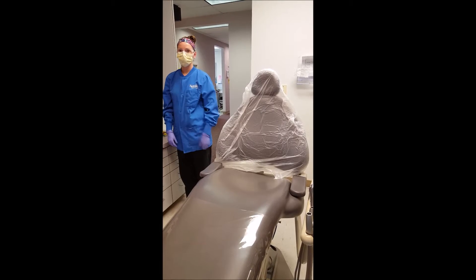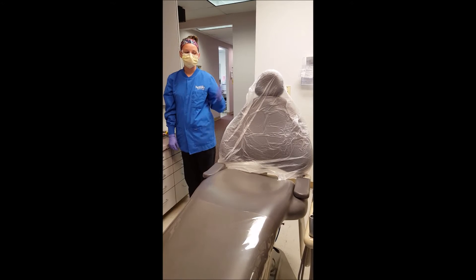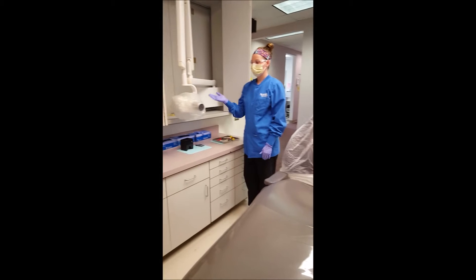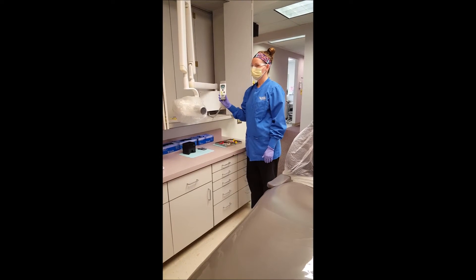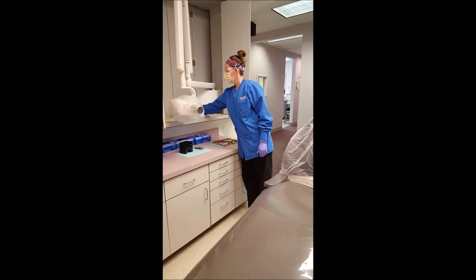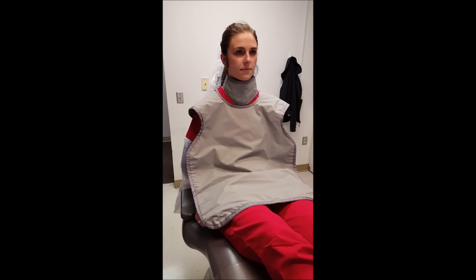The operatory will need pre-procedural asepsis and setup. Setup includes putting bags over the patient chair and x-ray tube, as well as protective barriers over the on-off switch and control panel. The patient will need to be wearing a lead apron and thyroid collar for protection.